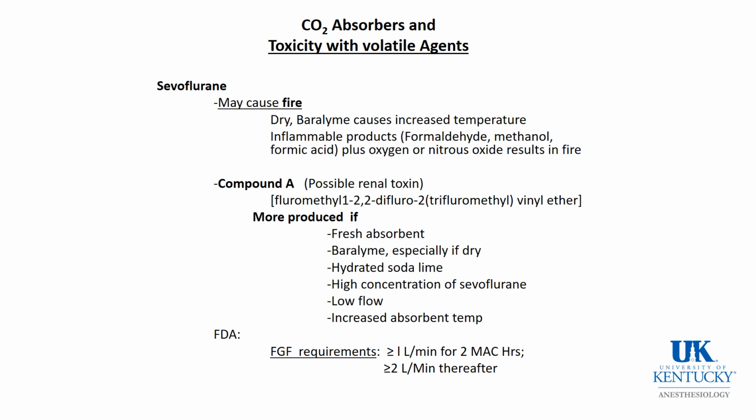Another potential theoretic problem is that when sevoflurane reacts with CO2 absorbent, it can produce compound A. I can't even read this, but you can, or say it. I can read it. And anyway, this is compound A. And the concern is that it may be a renal toxin.